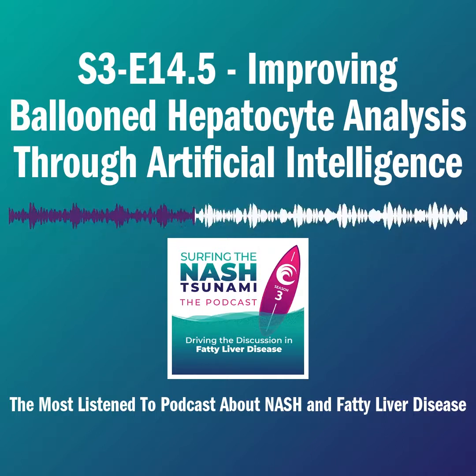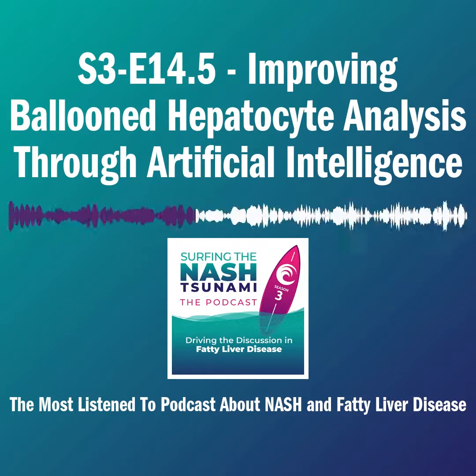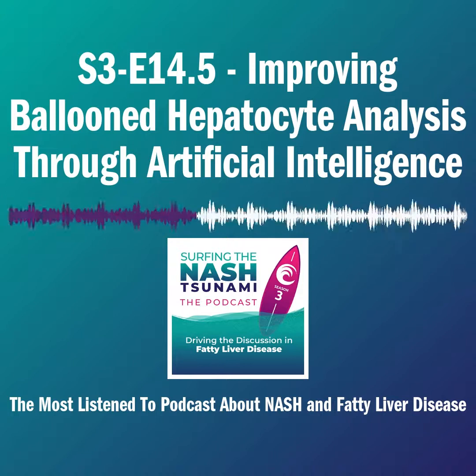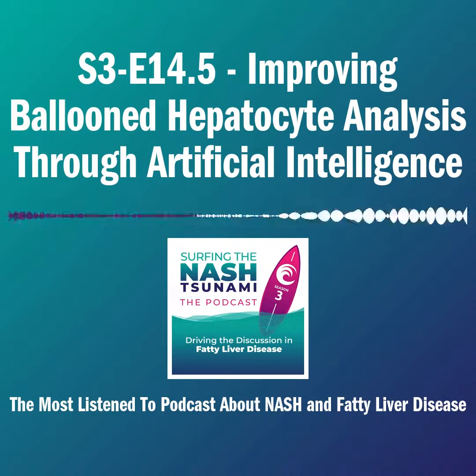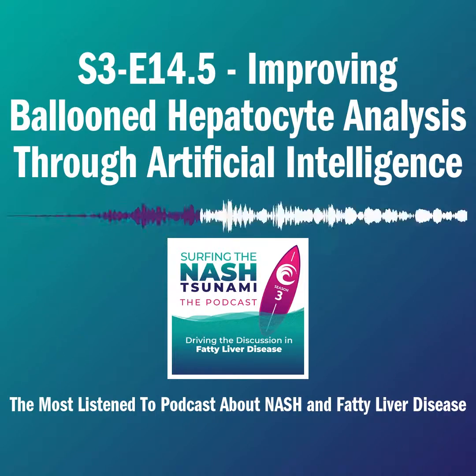So for right now, what we are working on is definitely, I think one thing is to correlate these with clinical endpoints. Basically, I think that's the best way to answer this question. Meanwhile, another thing we're looking at is what we call colocalization with fibrosis. This is something we are pursuing now with steatosis and fibrosis as well. What we have learned in steatosis is that when there's a significant reduction in steatosis, fibrosis changes not evenly across the biopsy.